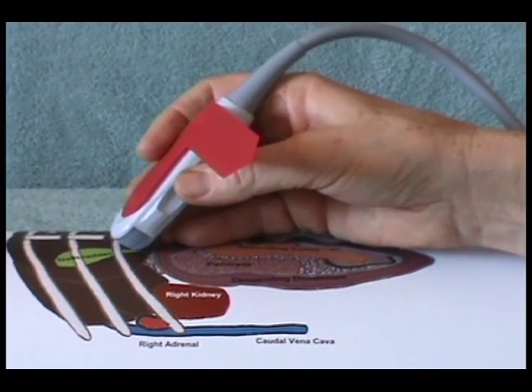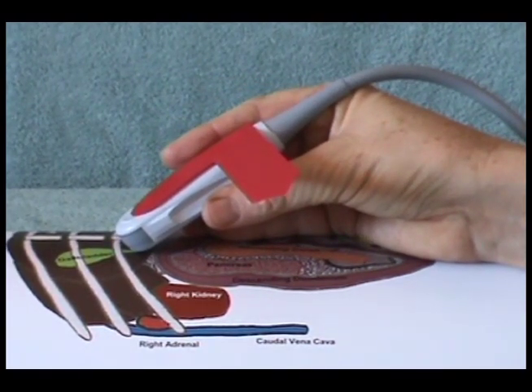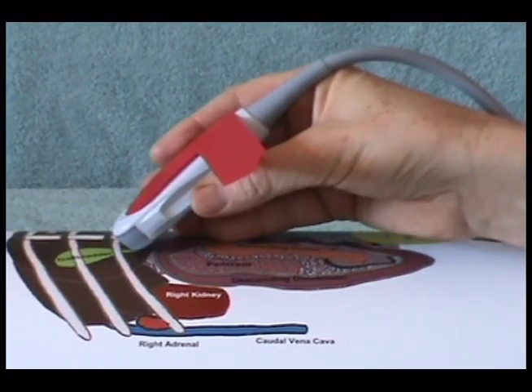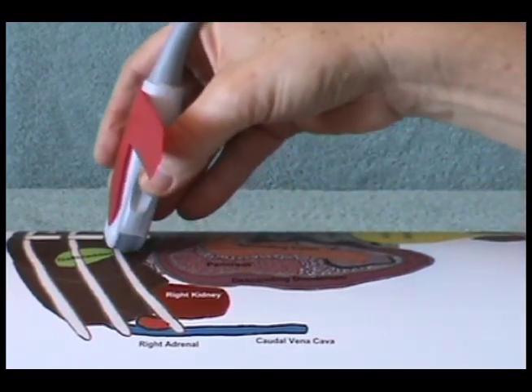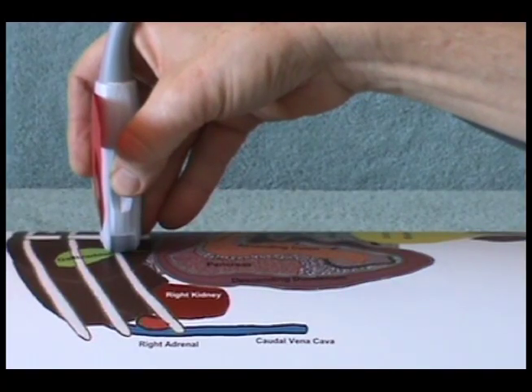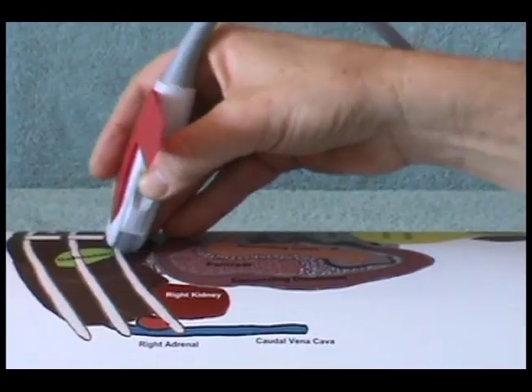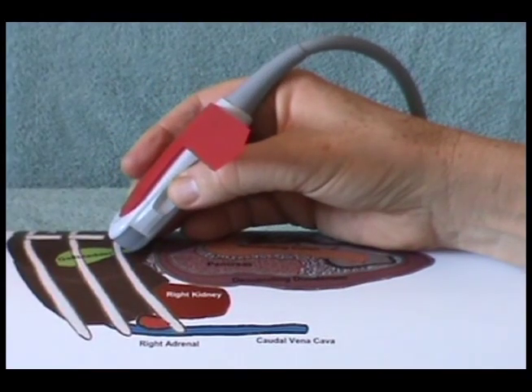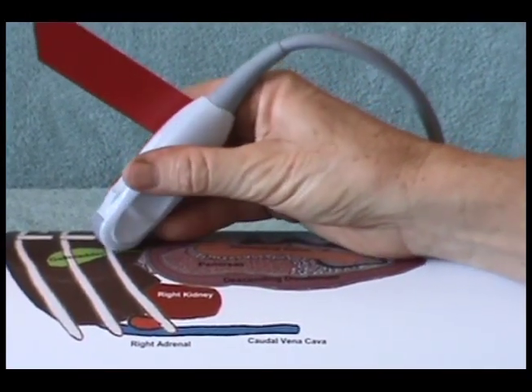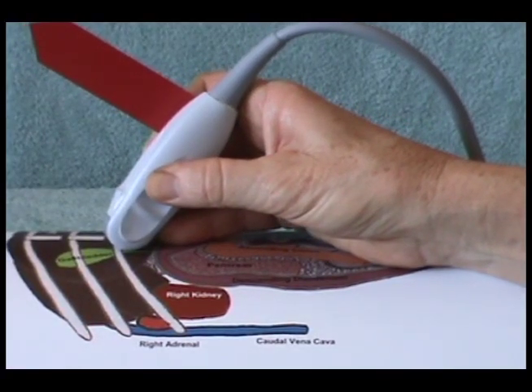Fan the transducer cranially as far as you can. Then reverse and fan caudally till the transducer is no longer pointing at the gallbladder. Return to the middle point of the gallbladder and rotate 90 degrees clockwise back to a sagittal position. Do not change the angle of the transducer while you are rotating.